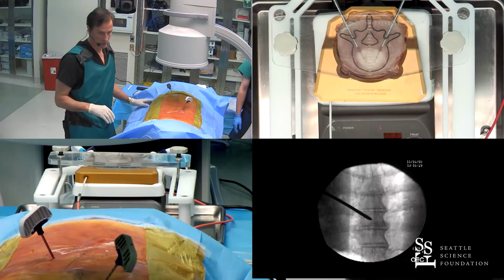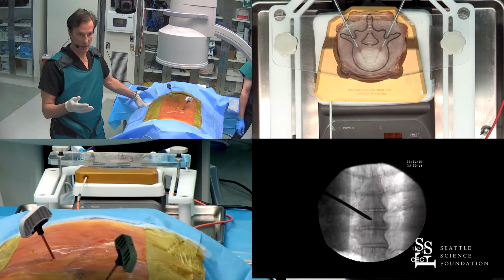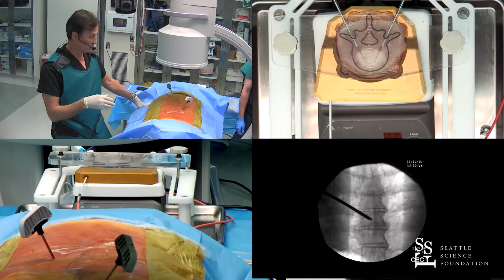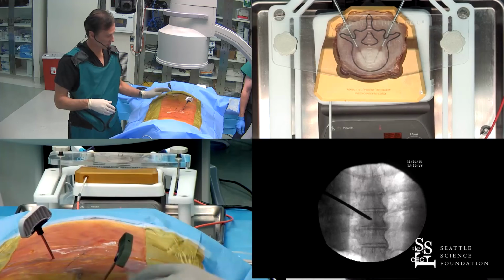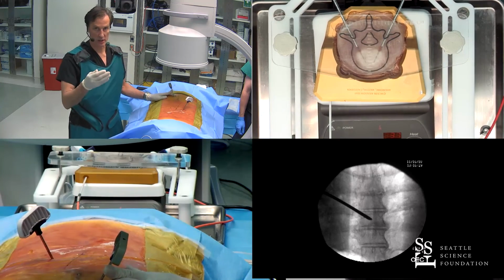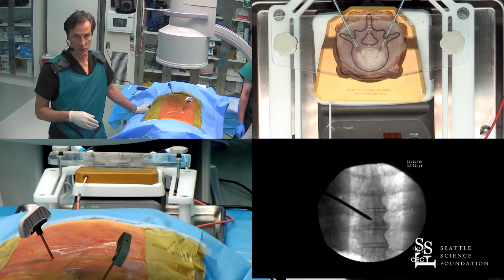So in this, toward the center, we could use a unilateral approach for unilateral access. We could steepen it up, pull it back, steepen it up here with not quite so shallow of a needle, and put a second needle in, use bilateral. Again, if you're looking for a reduction of vertebral height, a bilateral approach is preferred. Excellent.